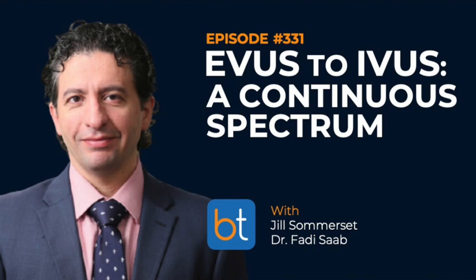And you can almost tell. Dr. Constantino will bring me in anyway, so we can try different angles. But you oftentimes know the cases that are going to be limited by EVUS, and then we have to rely obviously on our other tools, such as IVUS and fluoroscopy.